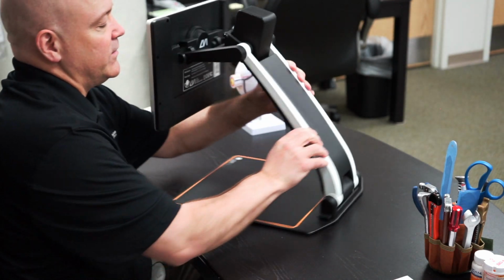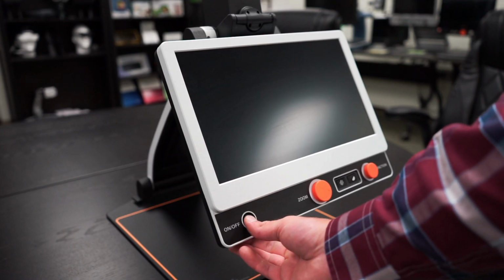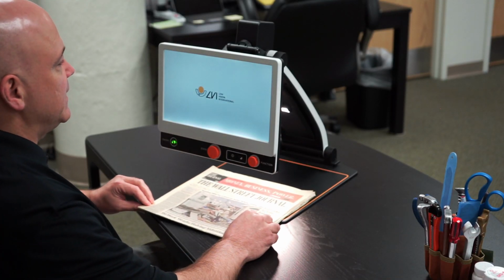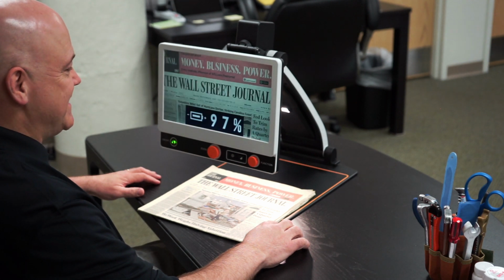Okay, so now the Zip looks like this. I'm going to press this power button on the left-hand side. What I like about the Zip is that the controls are extremely simple. It will turn green and then the unit will turn on. And as it's turning on, I'll put my paper underneath it. And in just a few more seconds, you're going to see the image on screen.